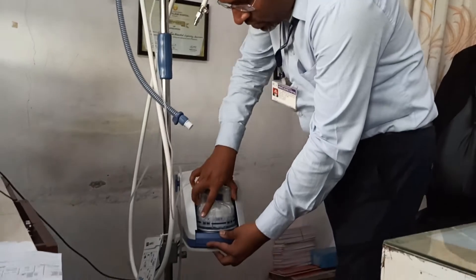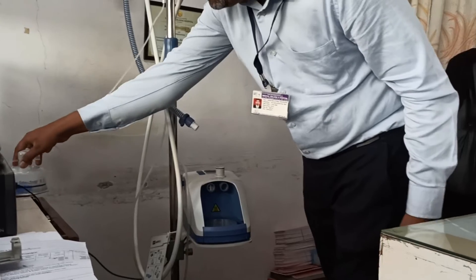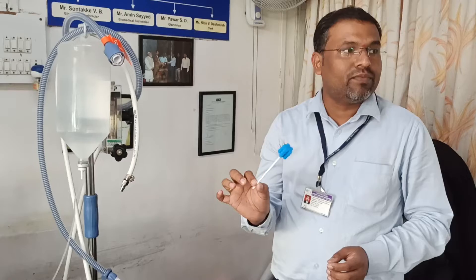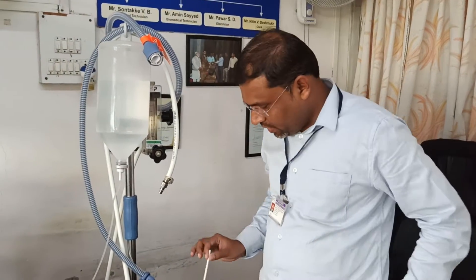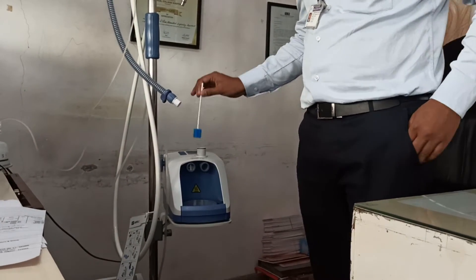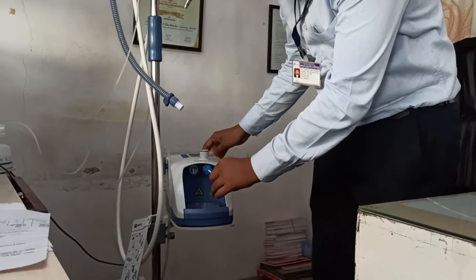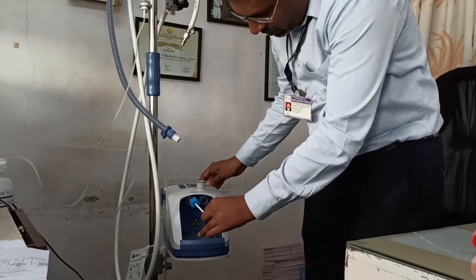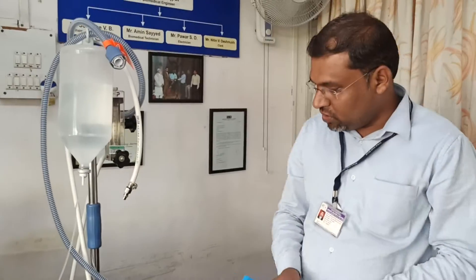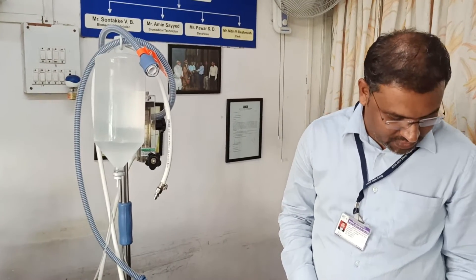You have to remove the humidifier properly and put it aside. Next, they have provided such type of gauze pieces, so you just clean the machine like this properly. You have to do all this procedure while wearing hand gloves.